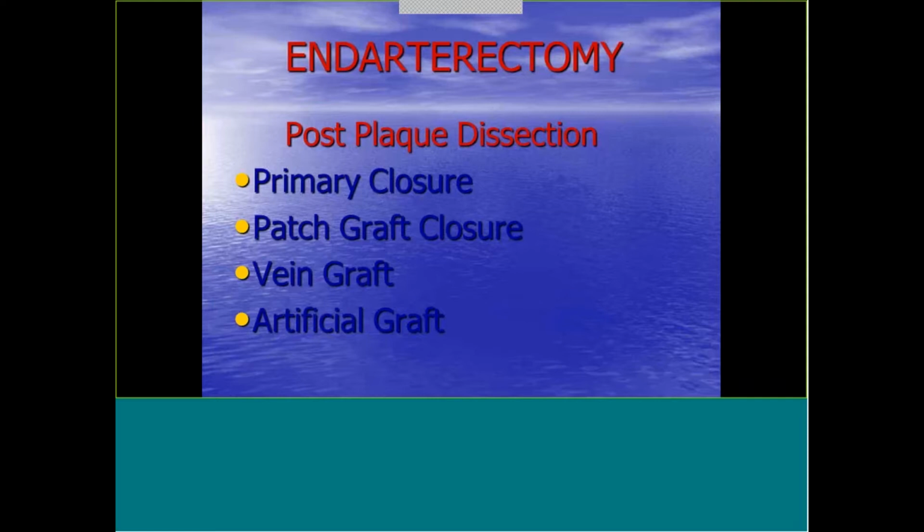Because remember, when you open the vessel up, you make an incision, you take it out. If you primary close it, so if you just sew it back up, it's going to take away some of the diameter of the vessel.